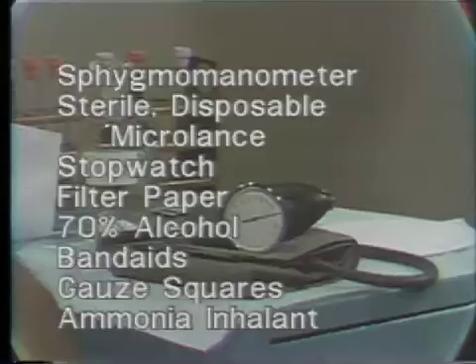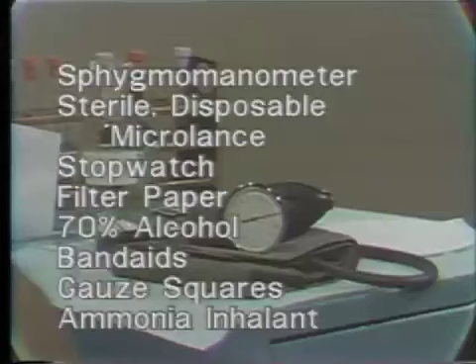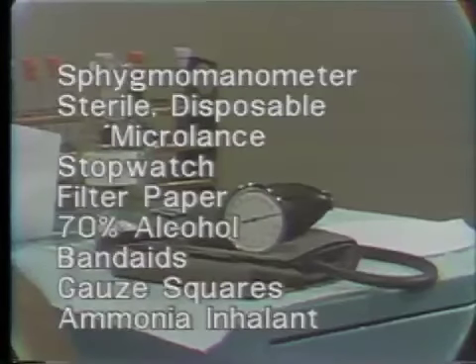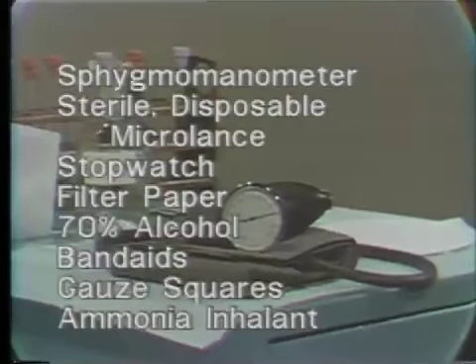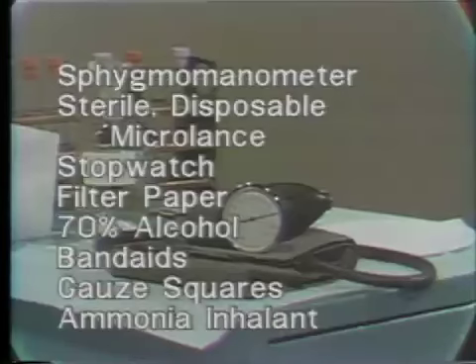The equipment necessary to do this study is a blood pressure cuff or sphygmomanometer, a sterile disposable micro lancet, a stopwatch, filter paper, 70% alcohol, Band-Aids, gauze squares, and ammonia inhalant.